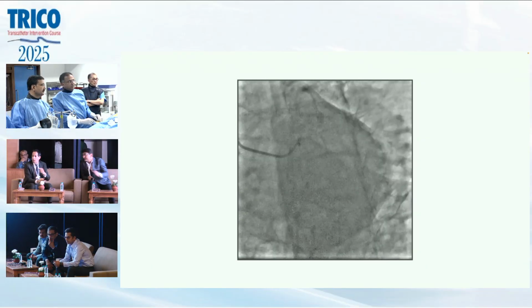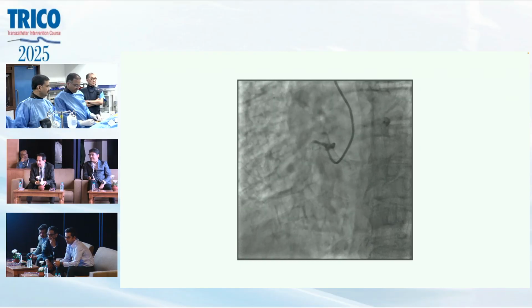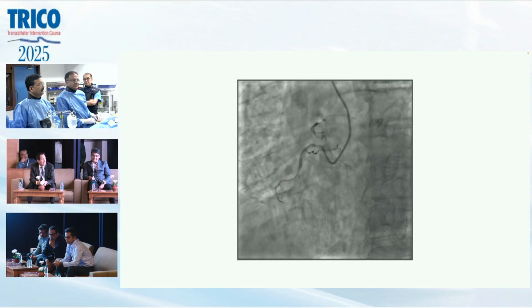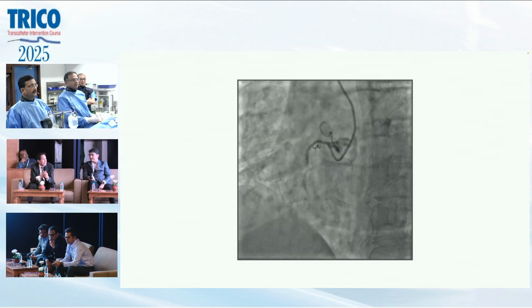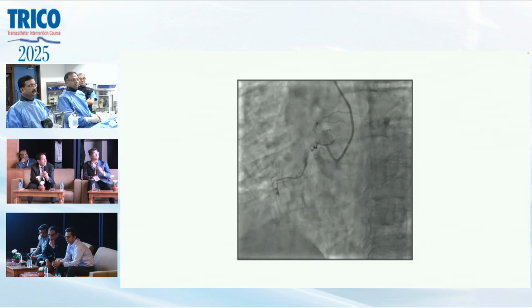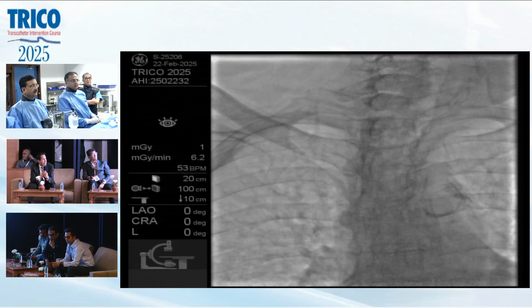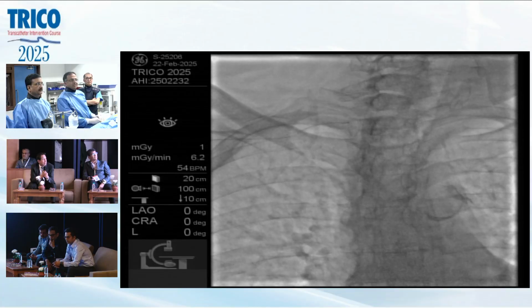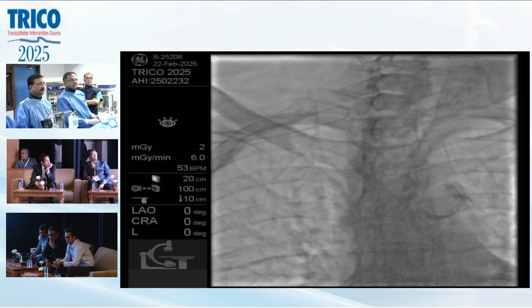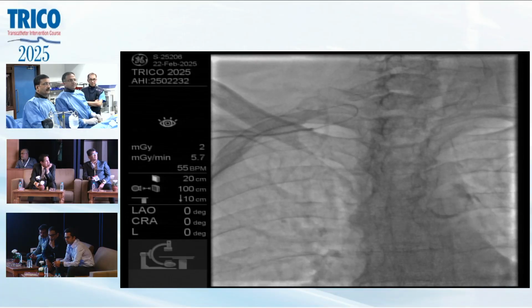Calcified, and the wiring we have. So we're going to put a 6 French EBU 3.5 guide with a telescoped catheter technique. We'll bring it all the way to the subclavian. There's some tortuosity there. We'll bring the JR4 there, and then we'll try to make it go down.